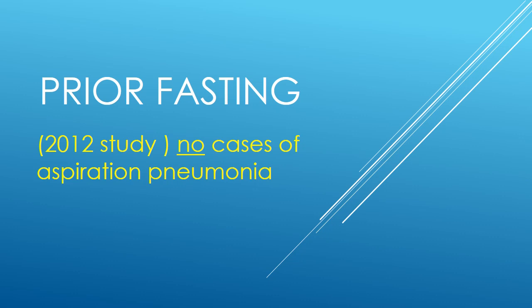Also, why do you keep the patient fasting? We kept the patient fasting in the earlier days because high osmolar contrast media frequently produced vomiting. And then we thought the patient might aspirate, end up in an ICU, so we kept the patient fasting. But here, surprise, surprise, in a 2012 study, there were no cases of aspiration pneumonia seen.